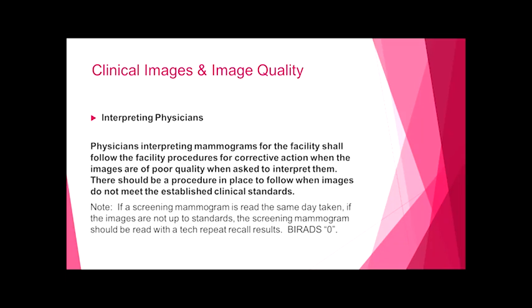And this is the process that they're talking about in some of the EQUIP initiatives that they want to be documented and verbalized. I don't want to say a policy, because unless it's a process that people are following, anybody can write a policy. But they want to know what process you're going to use to make sure that if the films don't meet this agreed upon criteria, how that's going to get communicated.